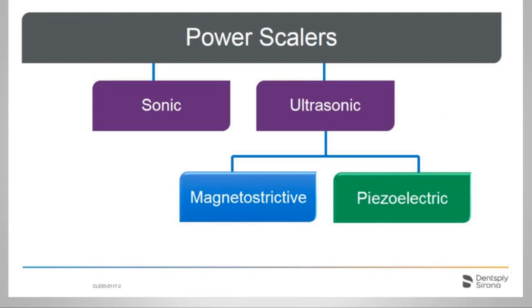So we'll take a brief look now at power scalers. And here's some revision of power scalers. The technologies are broken down into the sonic here and the ultrasonic, which then has the subcategory piezoelectric and magnetostrictive. My chosen method of instrumentation is the magnetostrictive here, and that's the focus of this presentation.